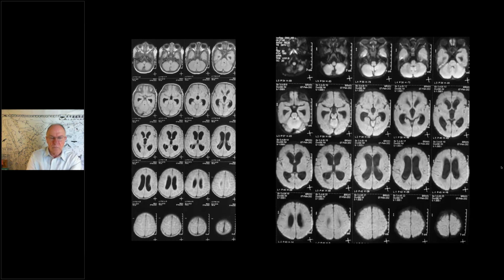This is a follow-up MRI, and on it you can appreciate that there is supratentorial ventriculomegaly. I cannot find any focal lesions, but the lateral ventricles and the third ventricle are dilated. There is also some rounding of the temporal horns, but no significant periventricular interstitial edema, at least on the FLAIR images. On the diffusion, there are some areas of periventricular flaring, so there is some interstitial edema. No diffusion changes within the ventricles or the extra-axial spaces. No focal abnormalities. In the posterior fossa also, I cannot appreciate any signal changes on the DWI sequences.